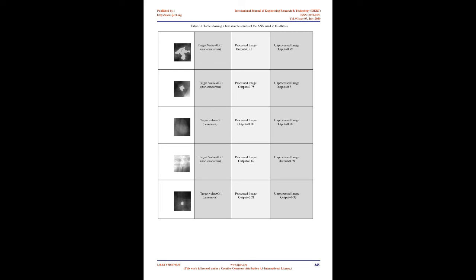1. The median is a more robust average than the mean and so a single very unrepresentative pixel in a neighborhood will not affect the median value significantly. 2. The median value is the value of one of the pixels in the neighborhood, so the median filter does not create new unrealistic pixel values when the filter straddles an edge. For this reason the median filter is much better at preserving sharp edges.